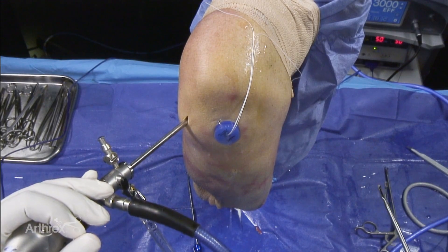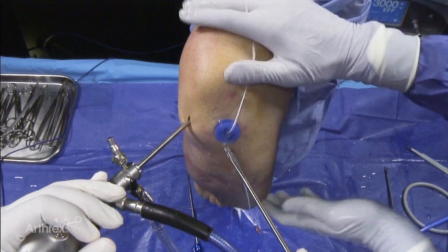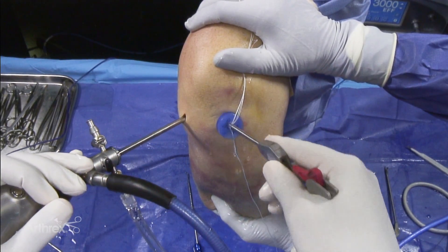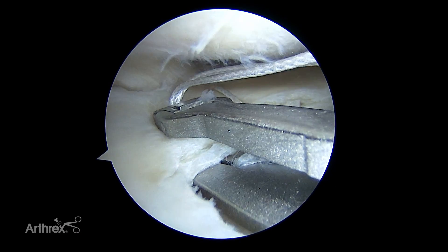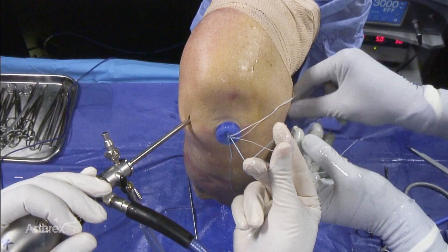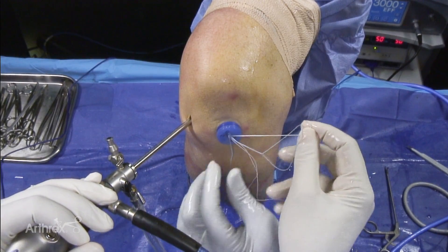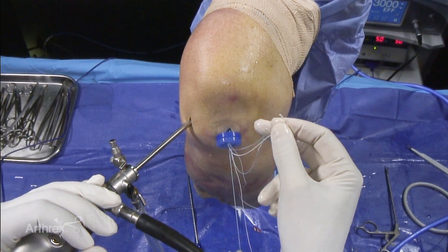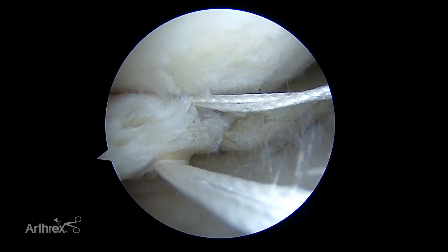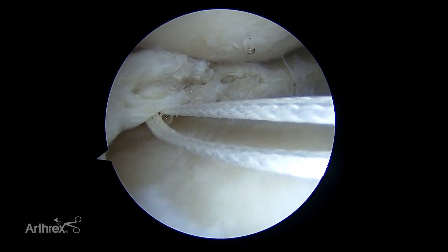Now we're going to pass an O fiber link and pass the loop down through the meniscus. We're going to take the loop from the O fiber wire and pull that in here — just using that as a shuttle. Now we have the loop and the stitches on the bottom of the meniscus.